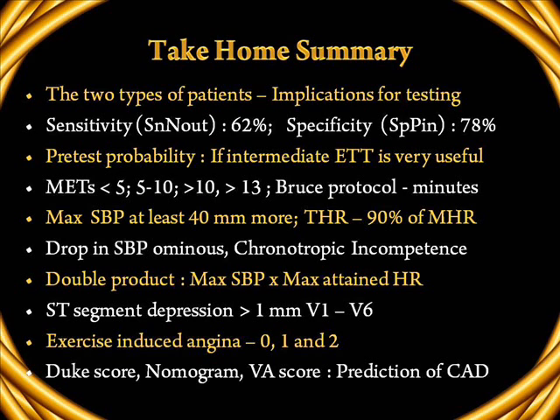That's how the whole story has unfolded, remembering that the sensitivity of exercise testing is comparatively low, around 62%. The specificity is good enough, around 70 to 78%.